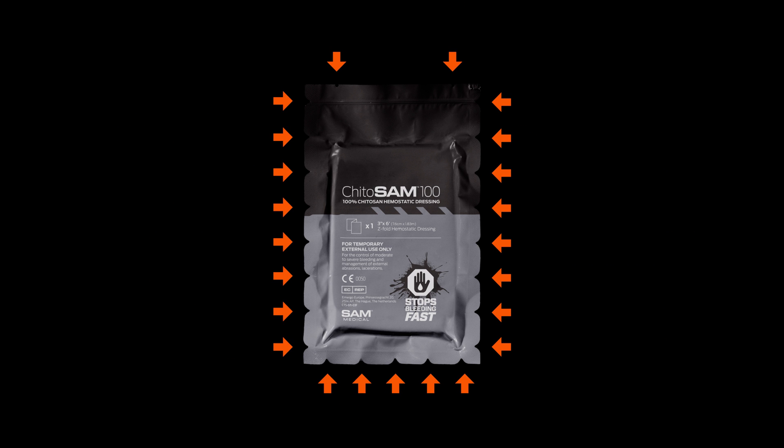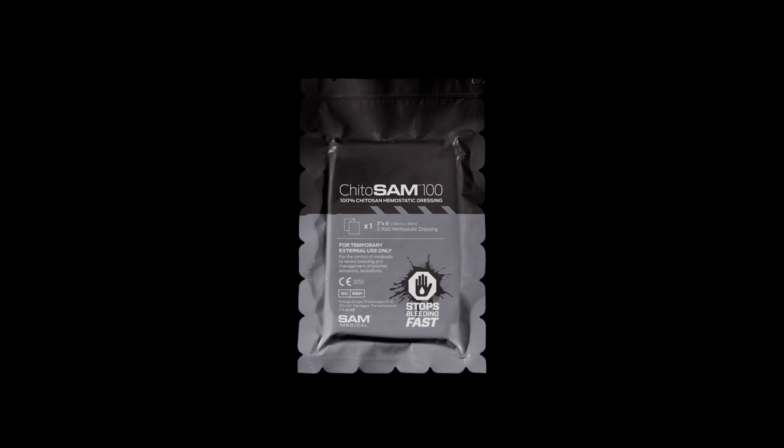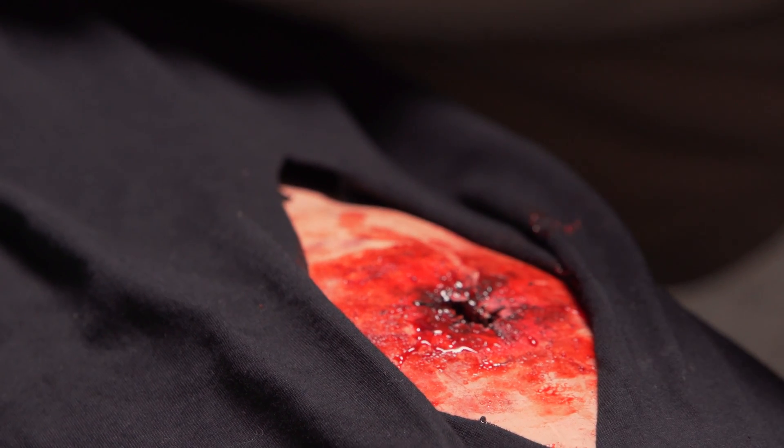Kaidosam's Tear Anywhere package design allows it to be quickly opened at any location. Quickly open the Kaidosam 100 and remove the dressing.